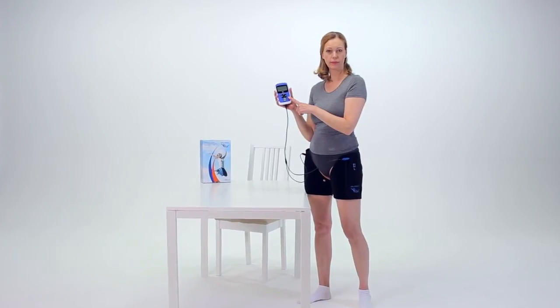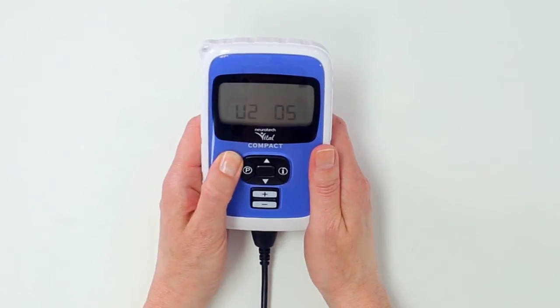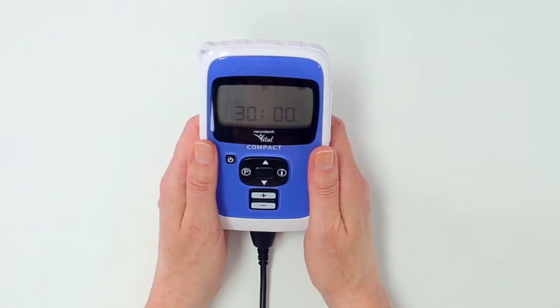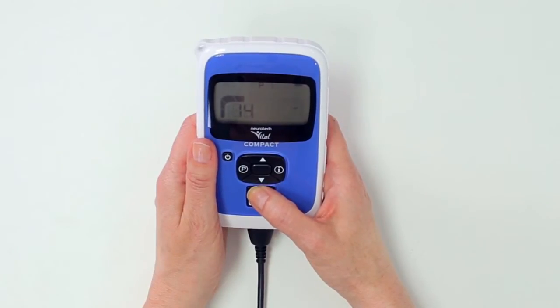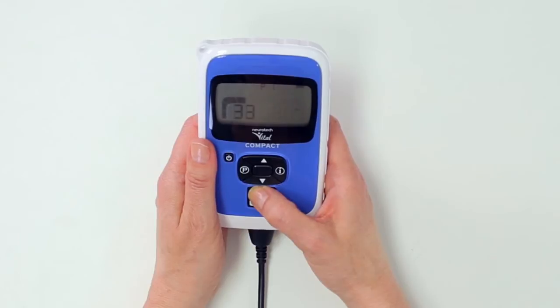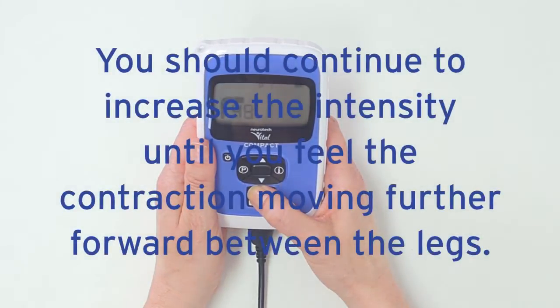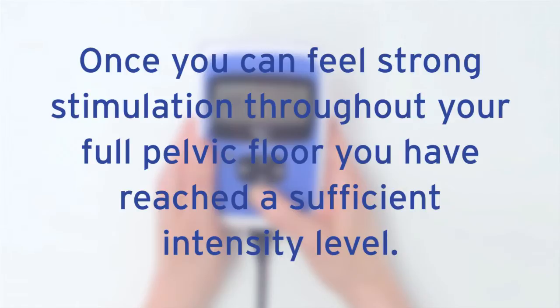You are now ready to begin your treatment session. Switch on the controller by pressing the on-off button. Start the treatment session by pressing the up-intensity button with a plus symbol on your controller. This button increases the intensity of the stimulation. Keep pressing this button until you begin to feel the stimulation. If you want to increase the intensity faster, press and hold this button down. You should continue to increase the intensity until you feel the contraction moving further forward between the legs. Once you can feel strong stimulation throughout your full pelvic floor, you have reached a sufficient intensity level.